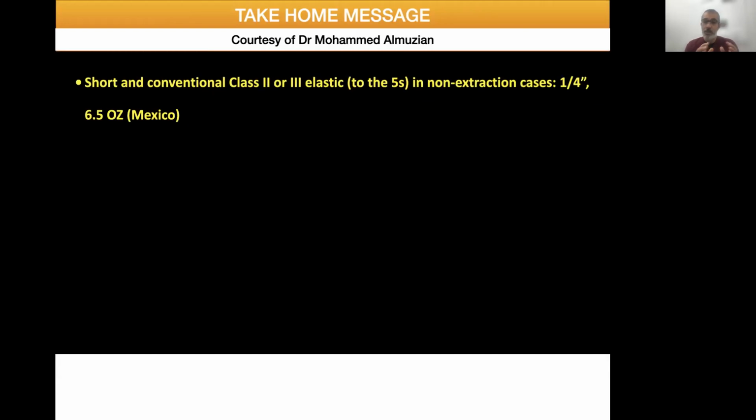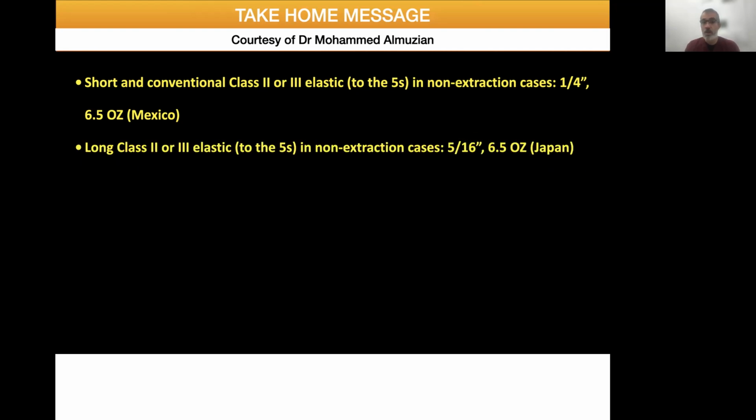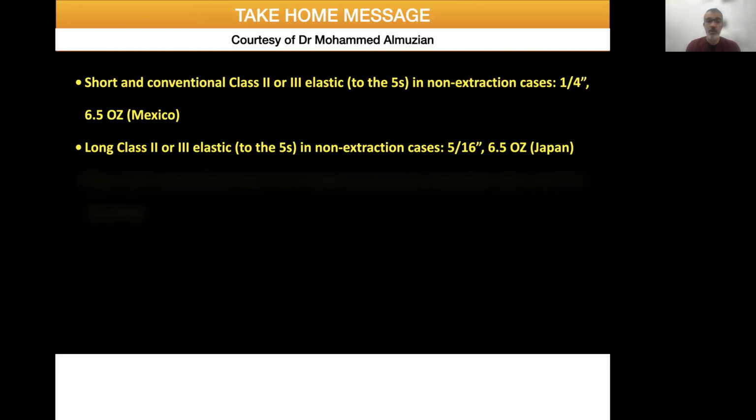However, in my clinic, I use the following protocol. You can print this, label it and put it in the cupboard so it will be easy for you to refer to. If you are using a short or conventional class 2 elastic, short meaning that it extends to the 5, whether it's class 2 or class 3, and the case is non-extraction, then use 1/4 inch 6.5, which is Mexico if you are buying it from OrthoCare. If it is a long class 2 or class 3 elastic in a non-extraction case, again use 5/16, which is Japan.